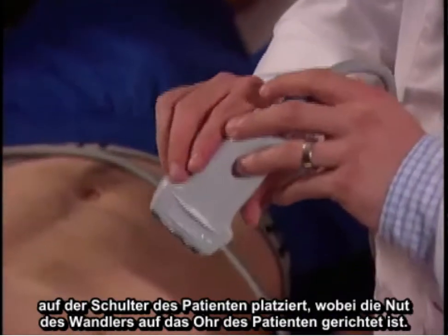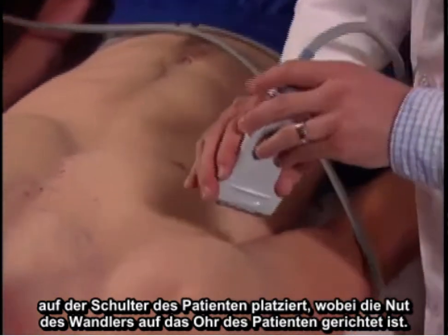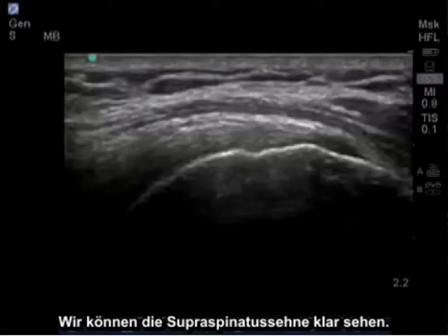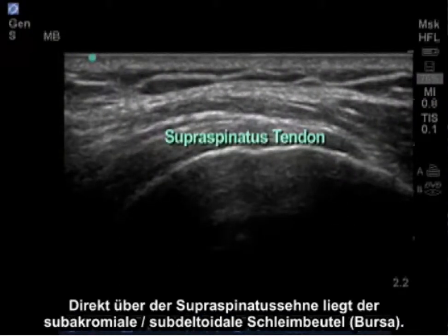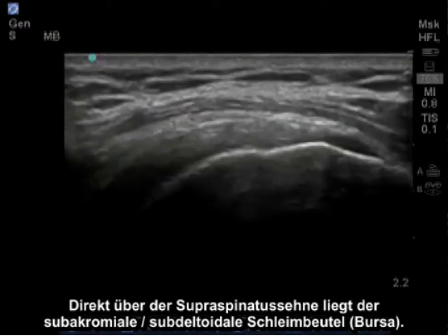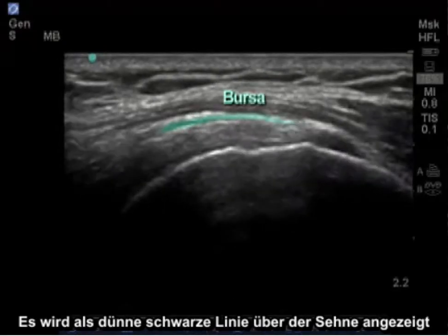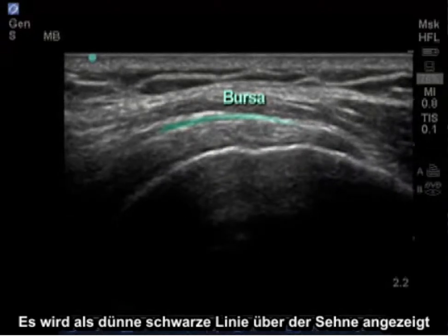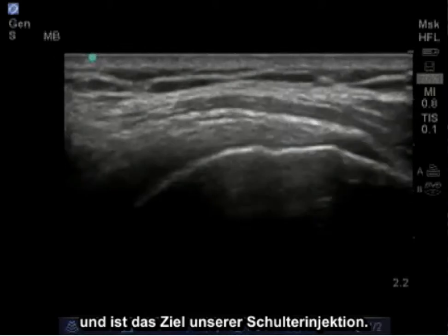we're going to place the transducer on the patient's shoulder with the notch of the transducer aimed towards the patient's ear. We can see the supraspinatus tendon in clear image. Just above the supraspinatus tendon lies the subacromial subdeltoid bursa.